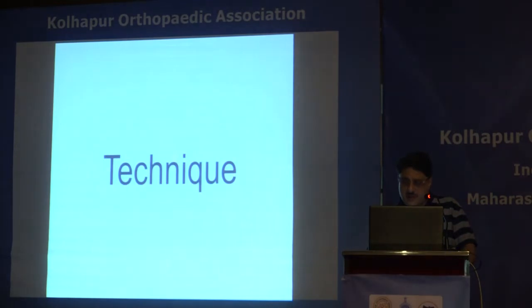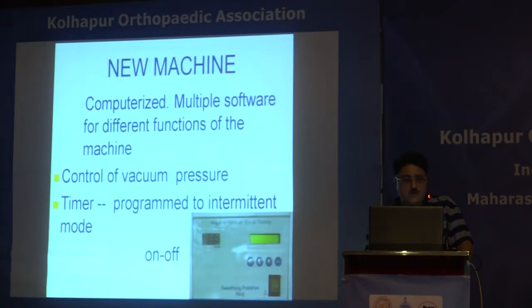So this is the technique. This is a video. I don't know whether it is working. No. Initially it started with simple suction. Then we started developing our own machine, which has software to give a good timer.